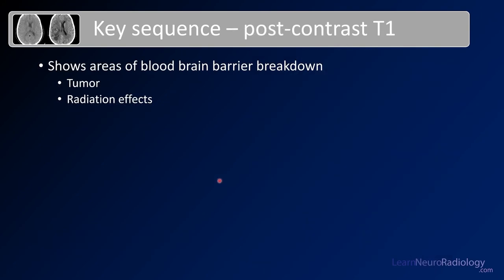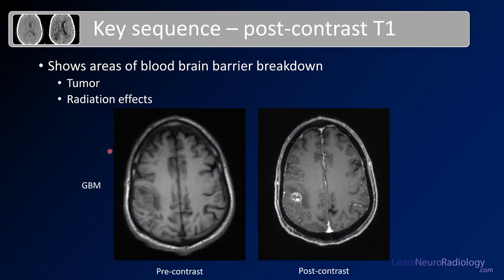The second key MRI sequence is the post-contrast T1, which shows areas of blood-brain barrier breakdown. That can be areas of tumor where the blood-brain barrier no longer exists, or from radiation effects causing injury to the blood-brain barrier. Here you see a pre-contrast image with a rounded lesion in the right posterior frontal lobe, with surrounding edema dark on T1. When you give contrast, the most infiltrative and aggressive areas of tumor — where there is blood-brain barrier breakdown — show contrast leaking into the tissue. That enhancing portion is the most concerning area of the mass.